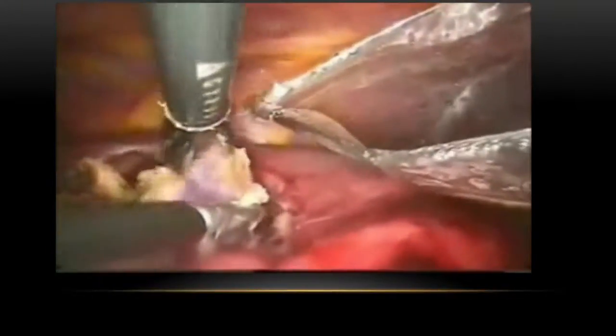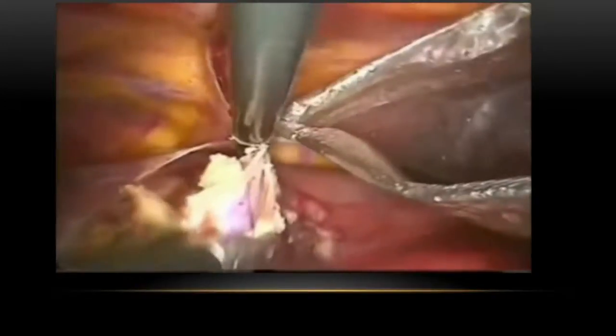And again, this is now clear. Again, repeated hypertonic saline. And again, suction will be done. Now again the de-roofing is continued. This is tripolar, so there is a cutting blade in between. Harmonic is equally good, ligature also you can use. Simple bipolar also can be used. Some people use hook as well. So this is now the remaining part of the interior surface of the cystic capsule removed.